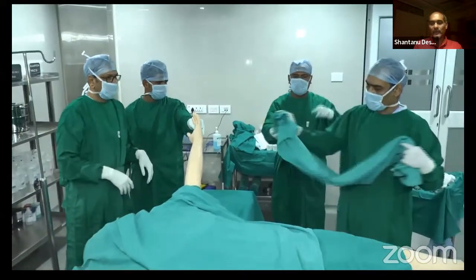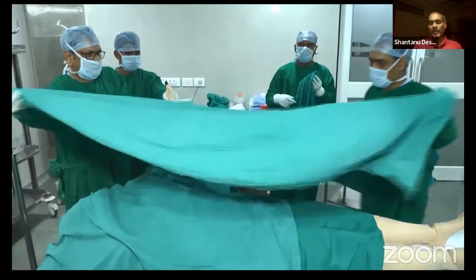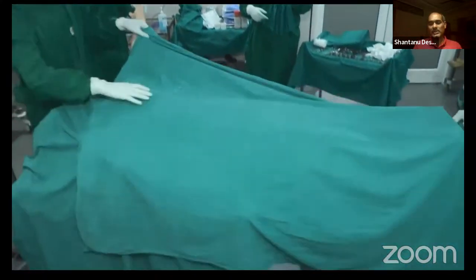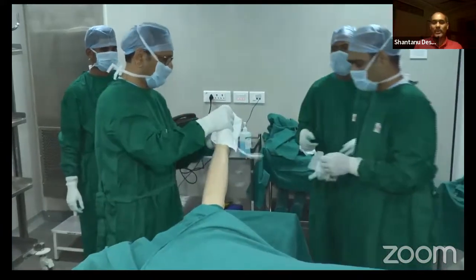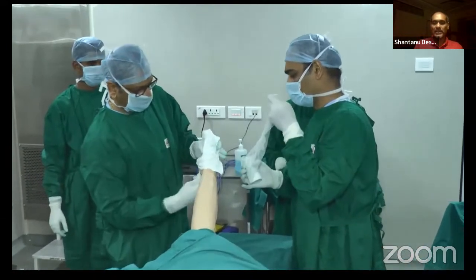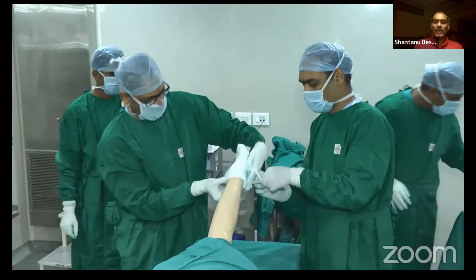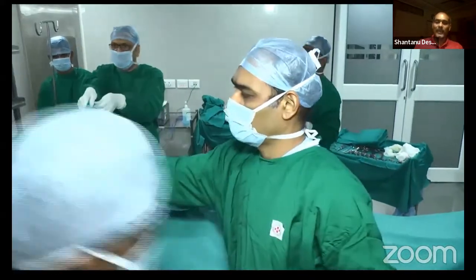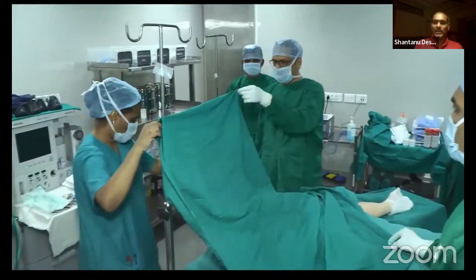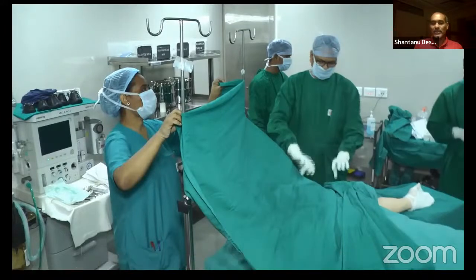What is remaining now is the lower end of the body. So a big sheet is taken covering the entire lower end of the body from toes up to the chest. Now, if you are operating on the forearm and there is no need to look at the wrist or the fingers, then one can use drapes, or you can even use a bandage, mop, and isolate the thumb. Another drape comes that is for isolating from the anesthesiologist over the two IV stand. This way, one can isolate from wrist, forearm, elbow, and lower end of the humerus.